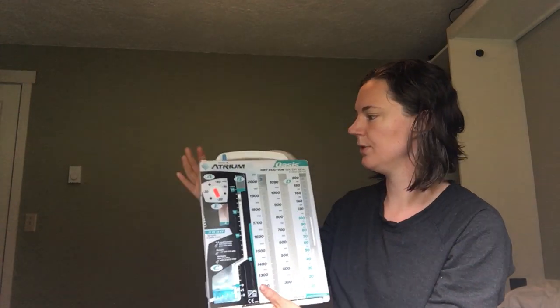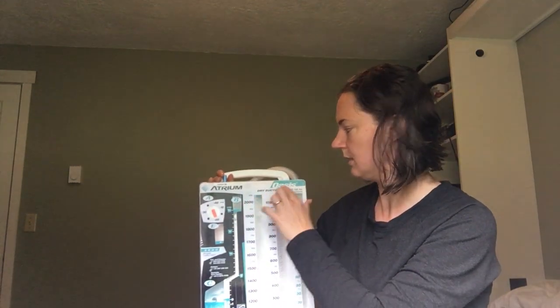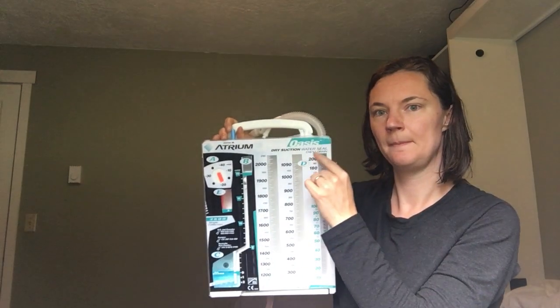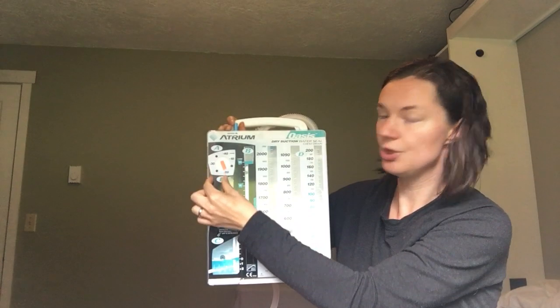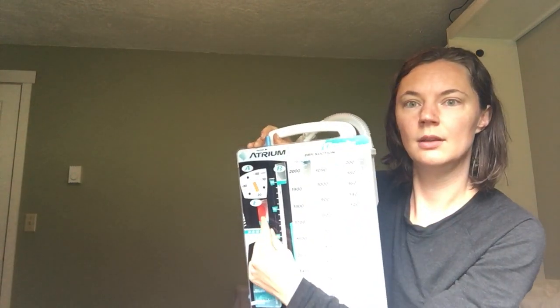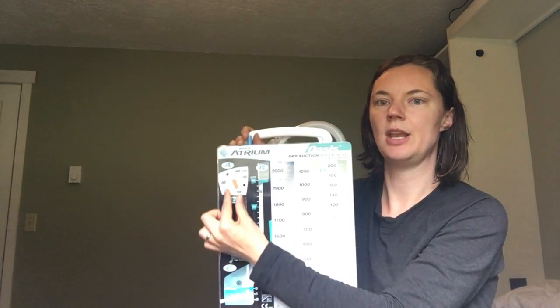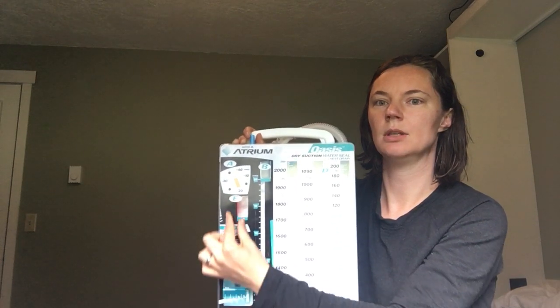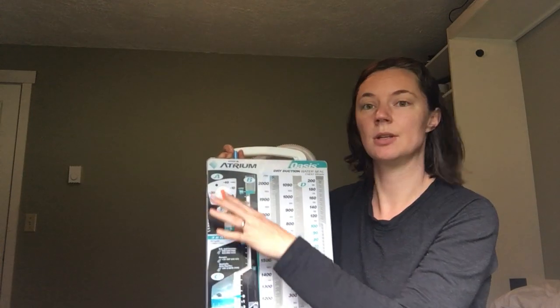And then from that point, we want to look at our chest tube atrium. We usually use this one that's called Oasis. Sometimes you'll see one that says Ocean. I'll show you a picture of it in a little bit, but the Ocean ones, instead of having this chamber with this orange accordion that will come out when the suction is on, they'll have a chamber right here of bubbling water that will bubble when you plug it in and not if you don't, and is up to a certain level based on the suction.